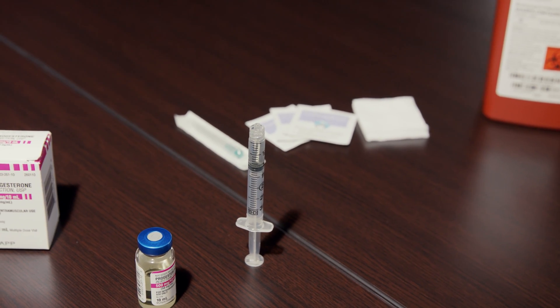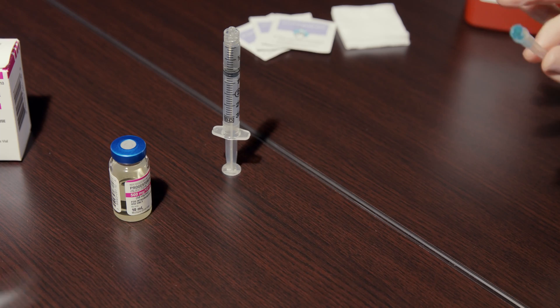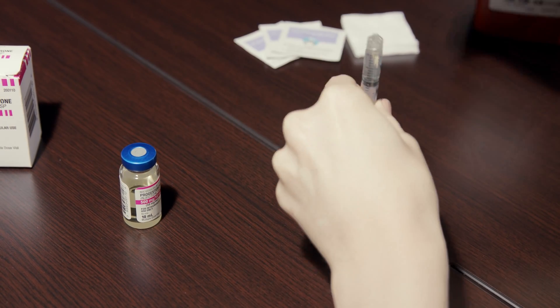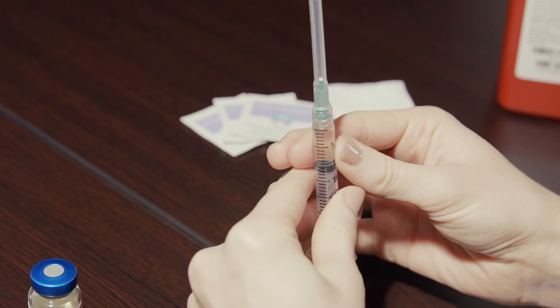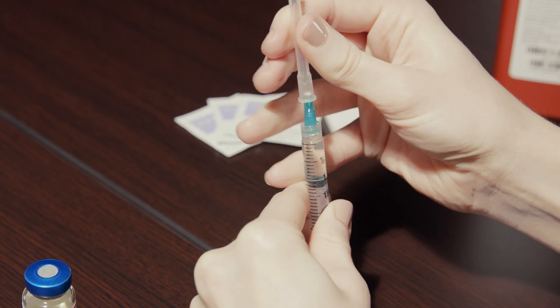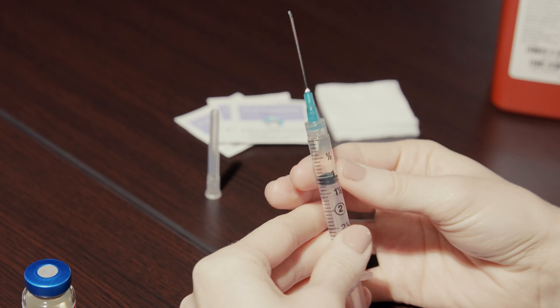Stand the syringe on a flat surface. Remove the 23 gauge needle from the packaging and screw it onto the syringe. Hold the needle upright and remove the cap. Don't let the needle touch anything, including your hands.